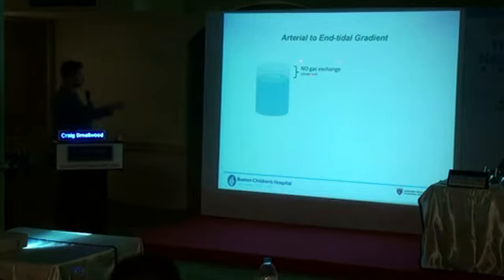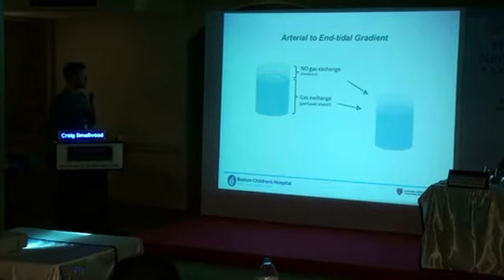So, no gas exchange during the dead space. We have a part that is the arterial gas. It's perfused alveoli. We put those together. I'm going to shake up this tank if my animation works.